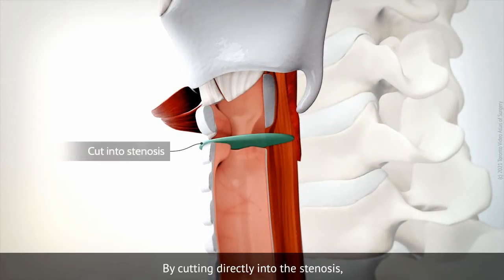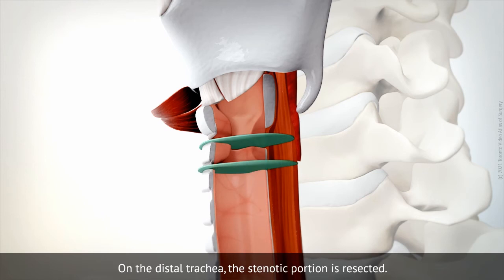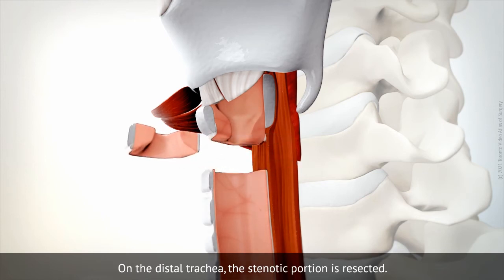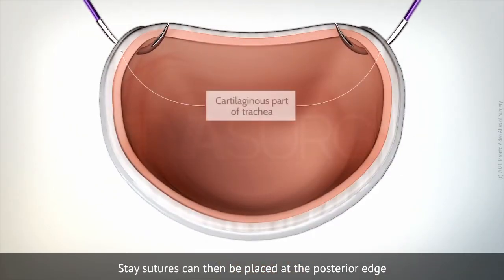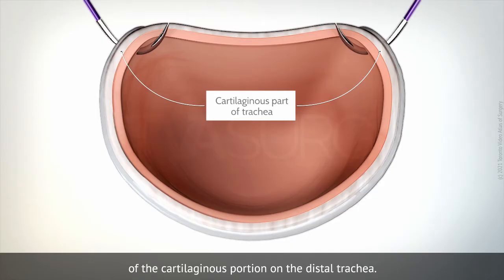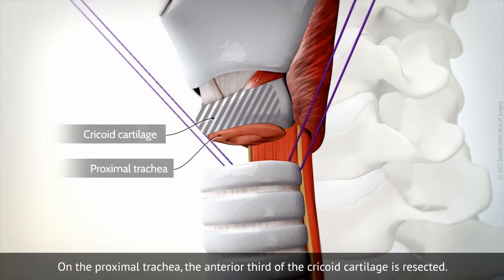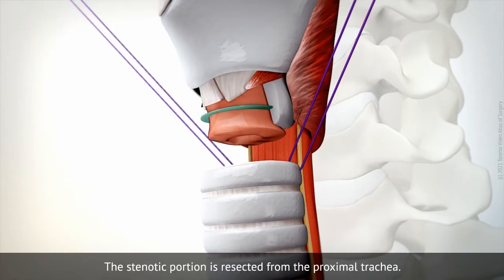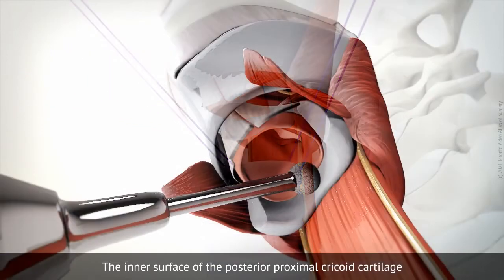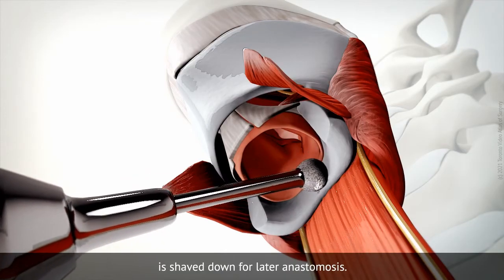By cutting directly into the stenosis, the minimal amount of trachea can be resected. On the distal trachea, the stenotic portion is resected. Stay sutures can then be placed at the posterior edge of the cartilaginous portion on the distal trachea. On the proximal trachea, the anterior third of the cricoid cartilage is resected and the stenotic portion is removed. The inner surface of the posterior proximal cricoid cartilage is shaved down for later anastomosis.